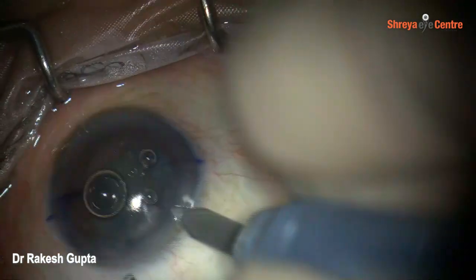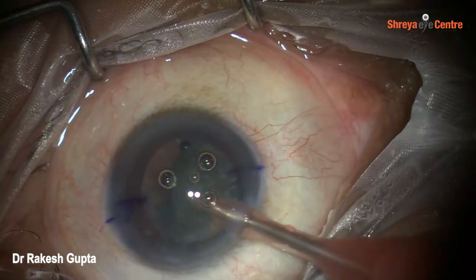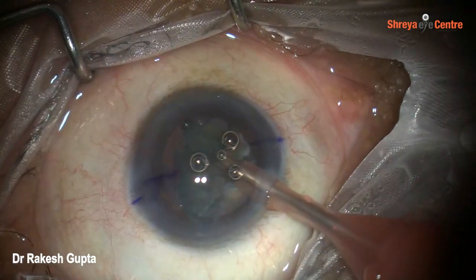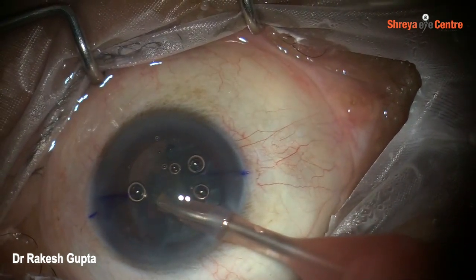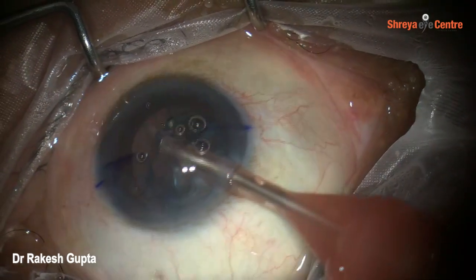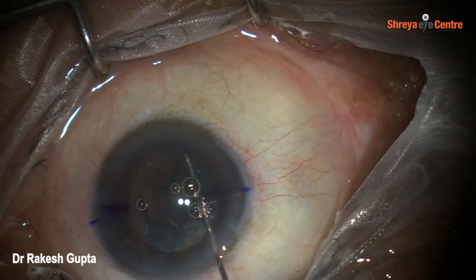Now you can see I am making a new phaco tunnel 2.2 mm supranasally because you can see that the PC rent has happened infranasally, so a new port placed supranasally will shift vacuum and aspiration away from the PC rent. And you can see I have been able to remove the lower half of the remaining nuclear and epinuclear plate successfully. I am injecting more viscoelastic under the anterior capsule, over the posterior capsule and over the area of PC rent.